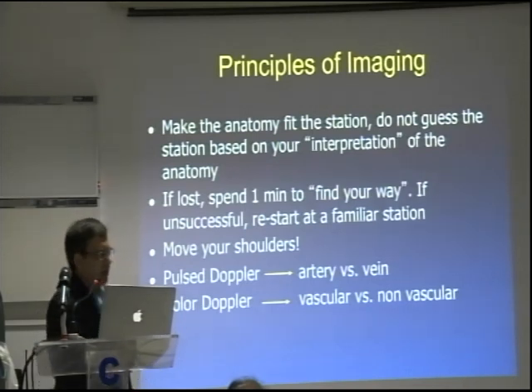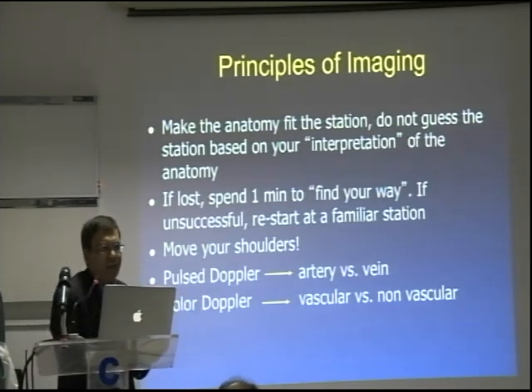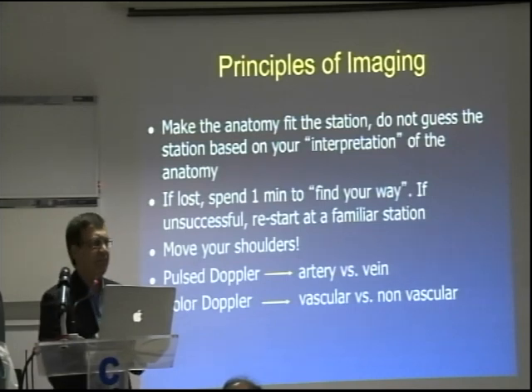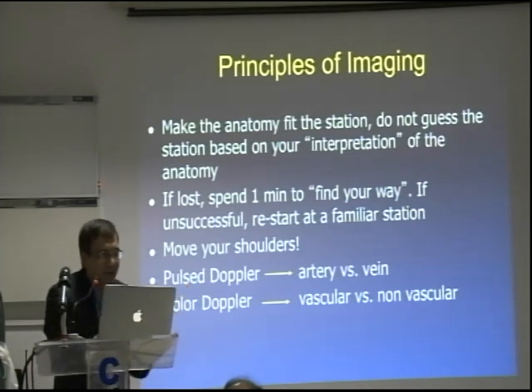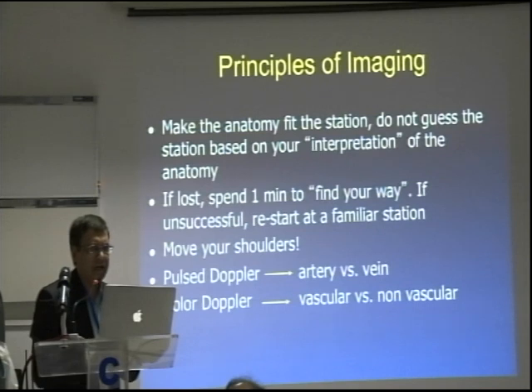And another thing, we talked about it being a dynamic procedure. It's not like you are just sitting there. Fellows, it becomes very frustrating for the teacher sometimes too. The trainee finds something and is so excited they don't want to move from there. It's looking really nice, and the teacher is asking, are you going to do something, or are you just going to sit there? Because it's not an ERCP scope. It's not a cannulation where you are going to be sitting there. You move. It's a dynamic procedure. You move your wrists, you move your shoulders, and I'll demonstrate that too.